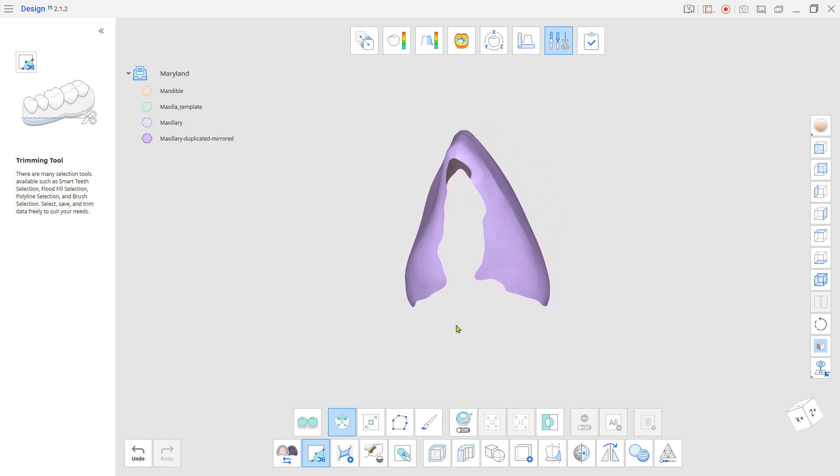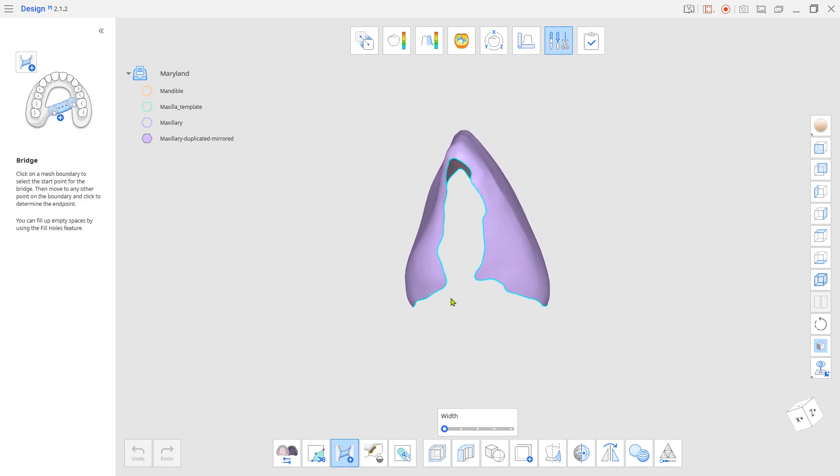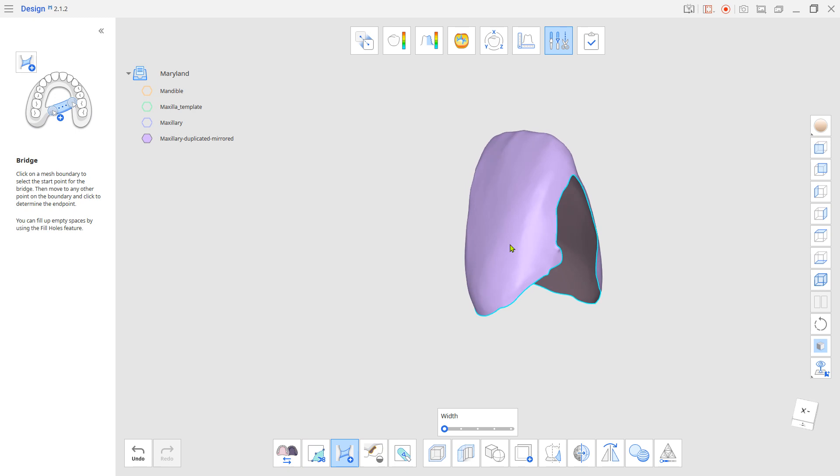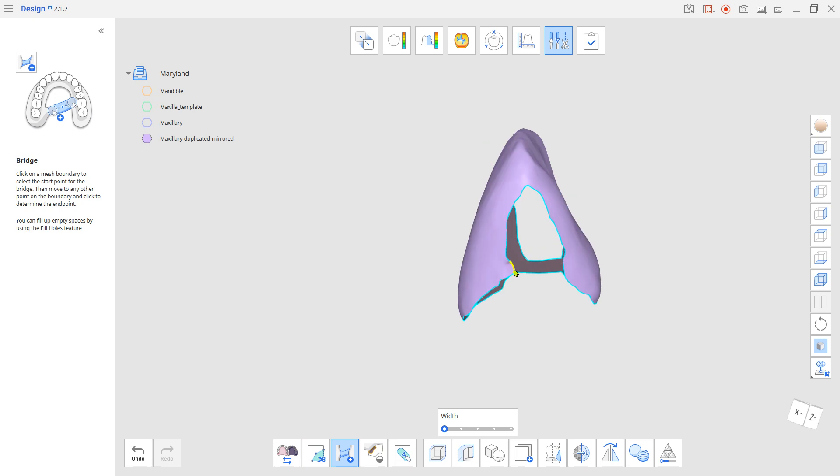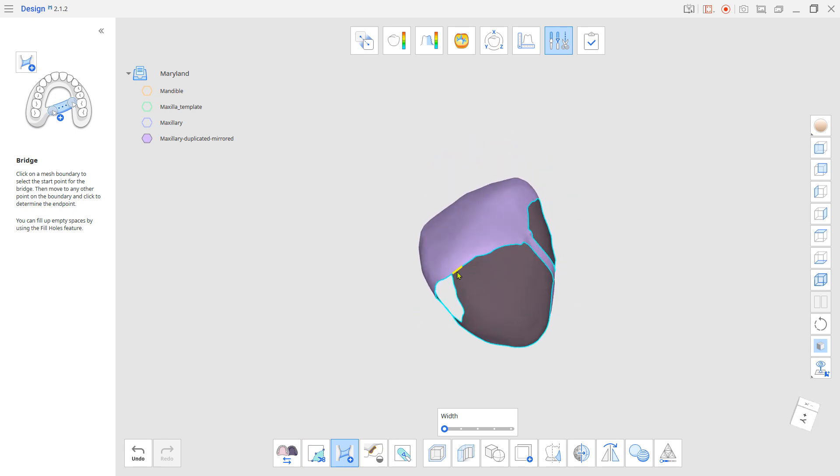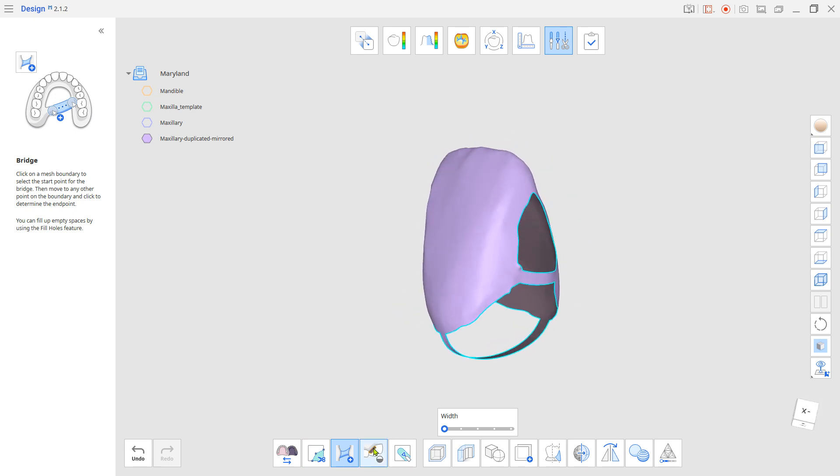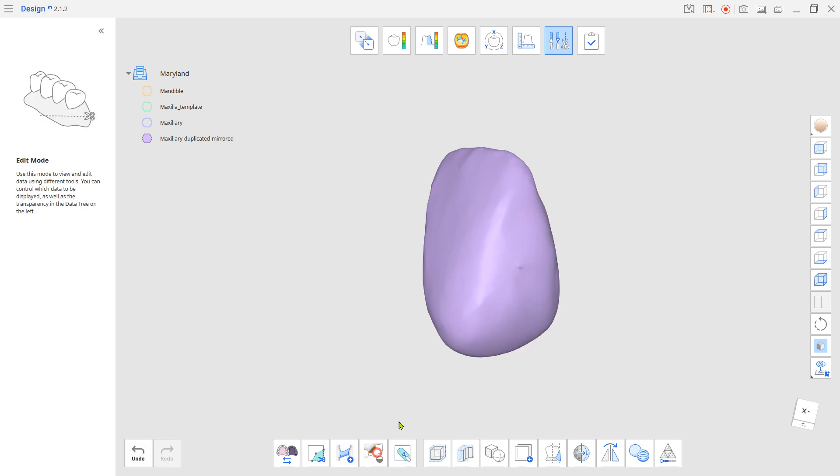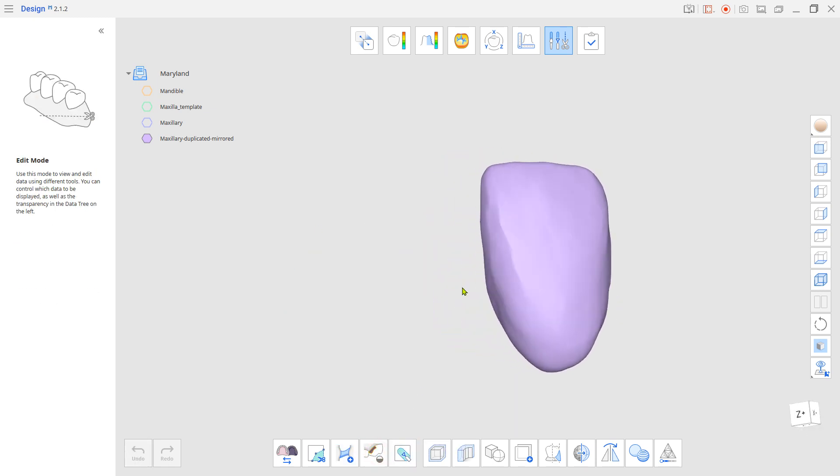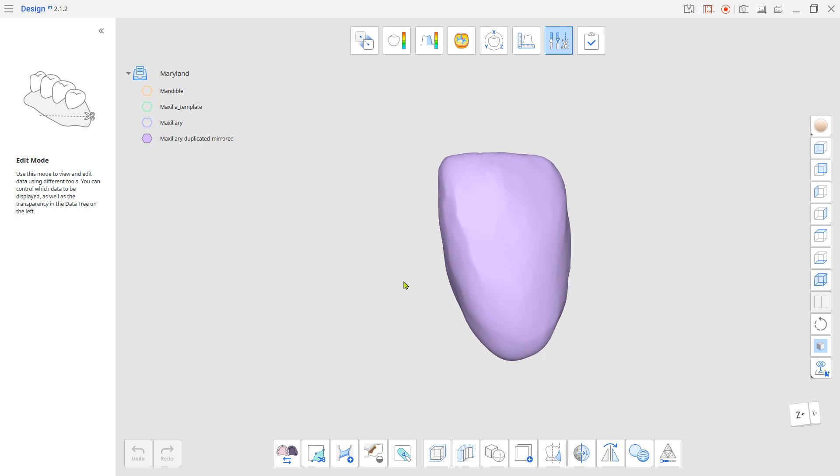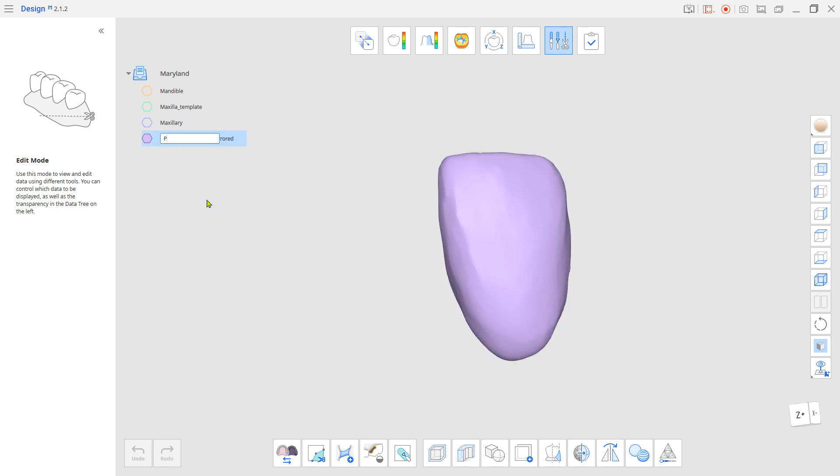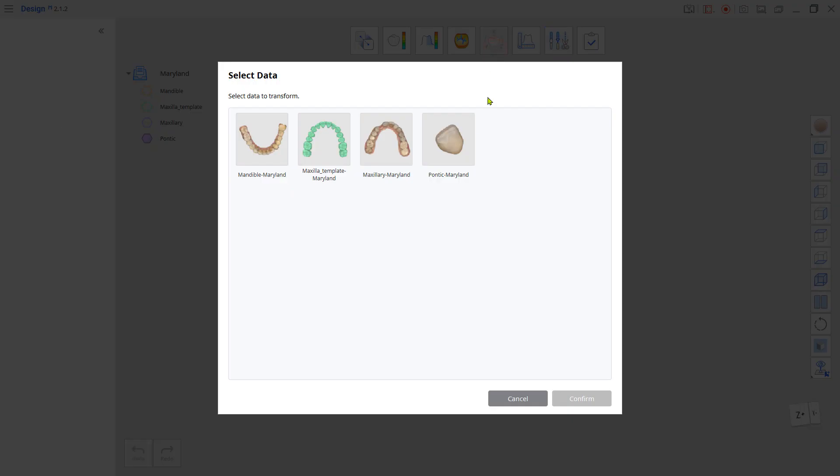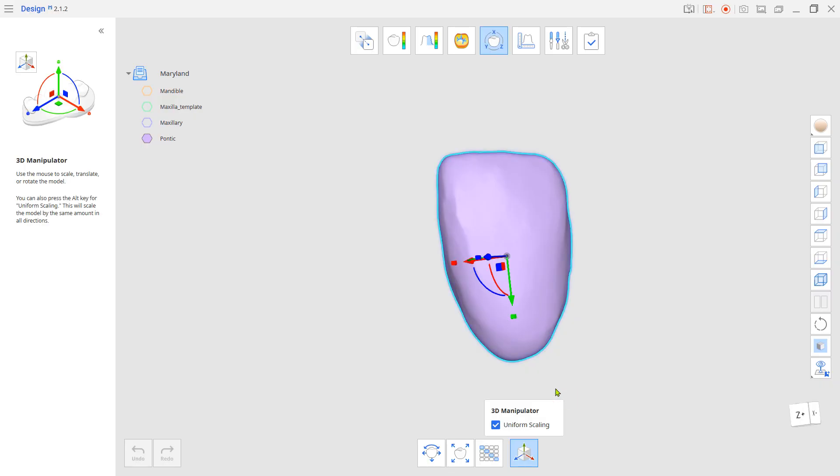Use the Bridge and Fill Holes tool to close any opened mesh. Go to Transformation Mode. Locate and Scale the Pontic Teeth.